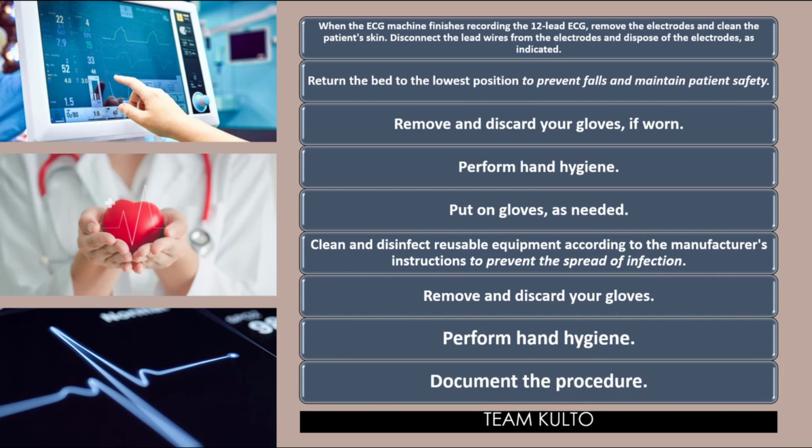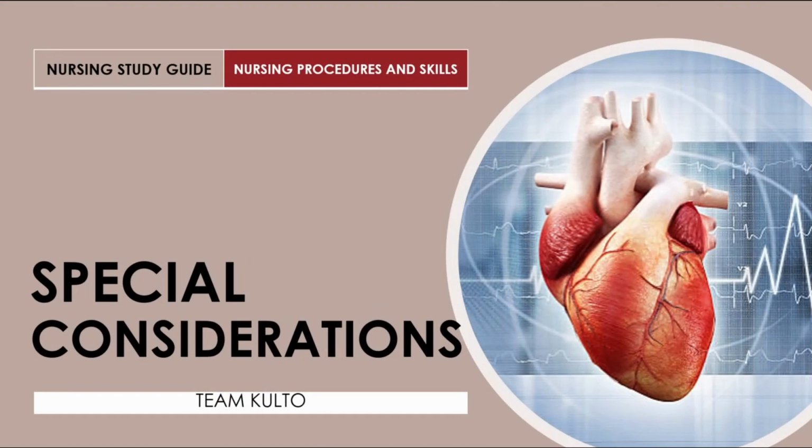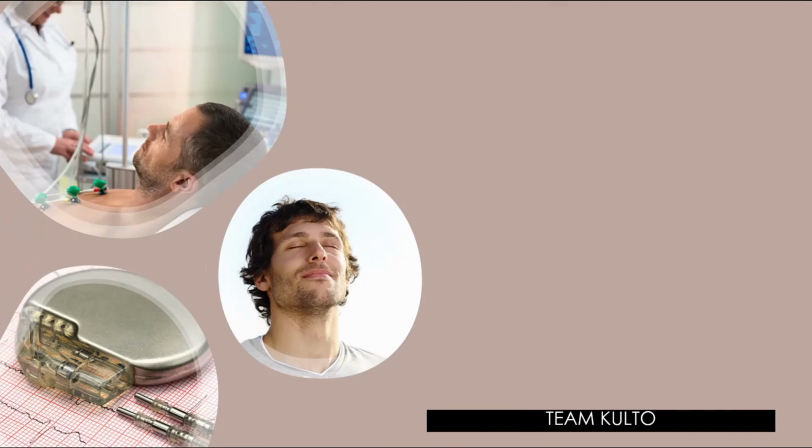Ang daming hand hygiene at ang daming gloving. Sa pag naglilinis, kapag naglinis ka na ng instruments, and right after mong matapos ang iyong procedure. Okay? Alright, special considerations na malapit na tayo matapos, nurses. Ano-ano ba yung mga dapat mong tandaan?